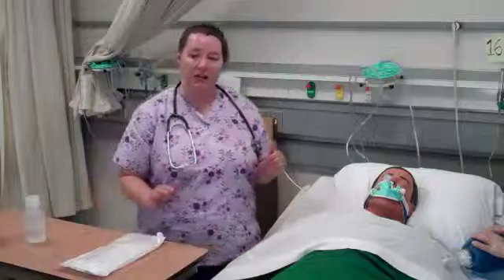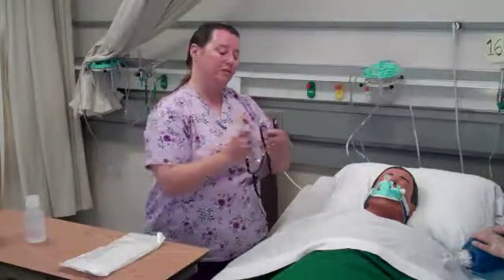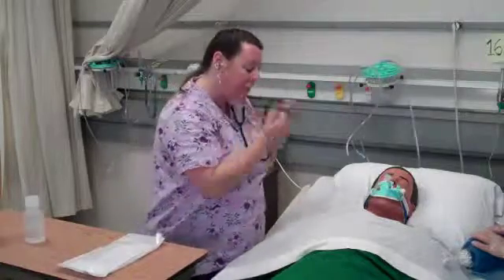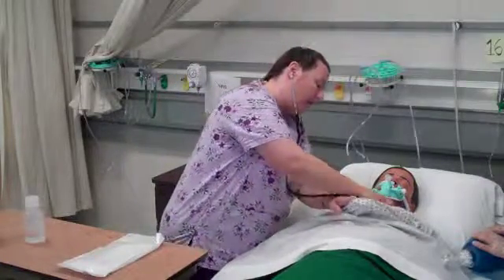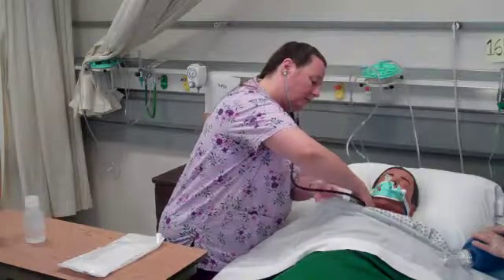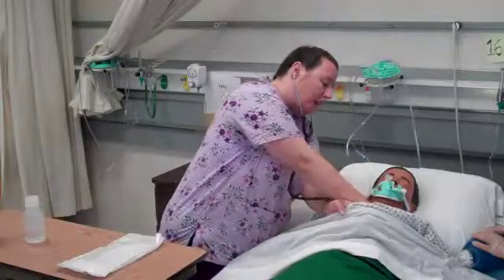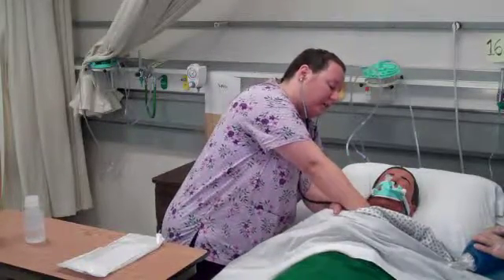So before I do any kind of procedure, I want to make sure I assess my patient. I'm going to use my stethoscope to go ahead and auscultate for his breath sounds. And I'm always listening skin to scope. I'm hearing adventitious sounds. I could hear rales. I could hear rhonchi, coarse breath sounds.